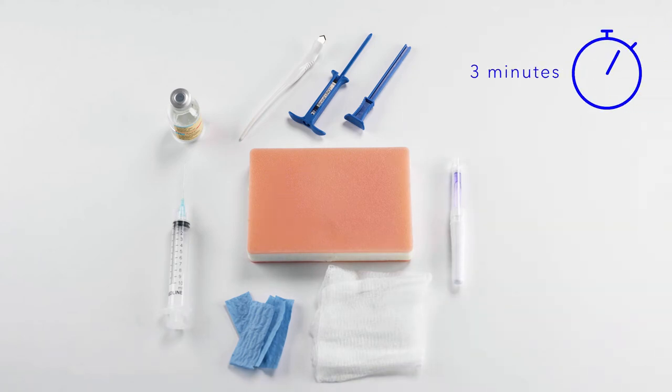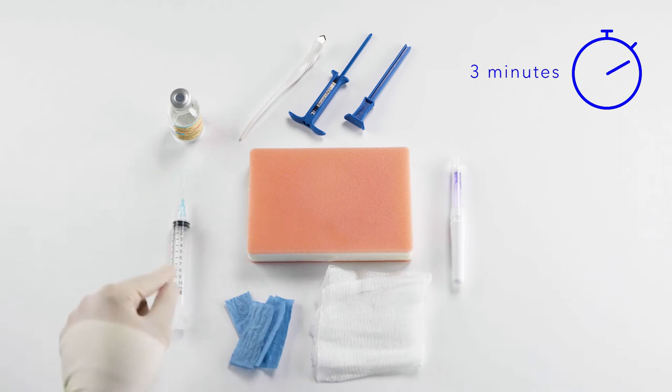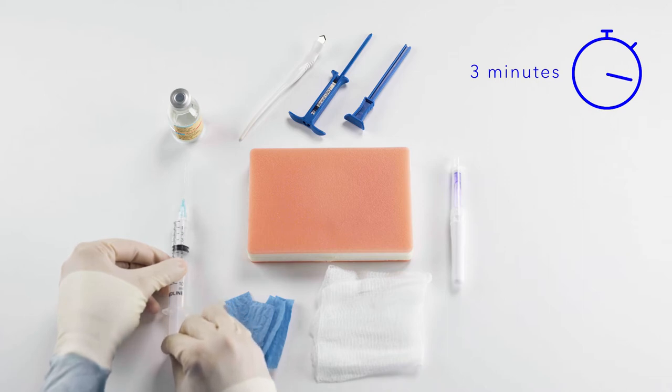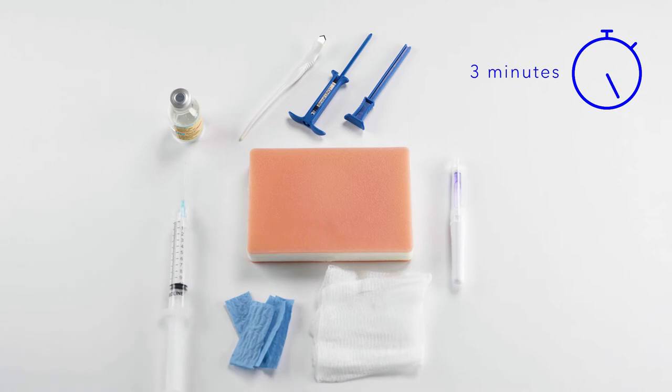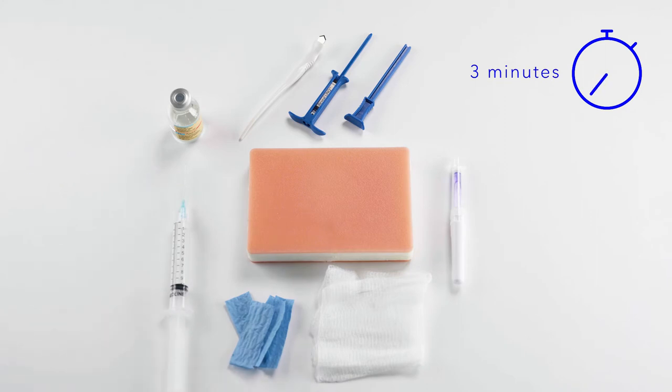While we're waiting for the chloroprep to dry, I'm going to prepare my 2% lidocaine with epinephrine. I like 2% because it's optimal for patient comfort, and I like epinephrine because it really controls those capillary bleeds to keep this procedure as smooth as possible. I recommend using 10cc, no more, as this is the optimal volume for patient comfort covering the pocket and also not overdoing it as to affect the R-waves.